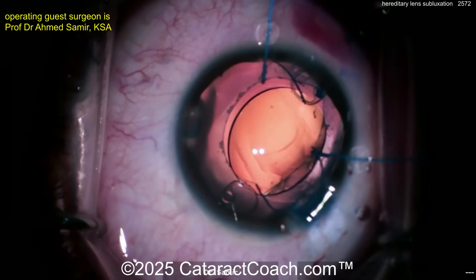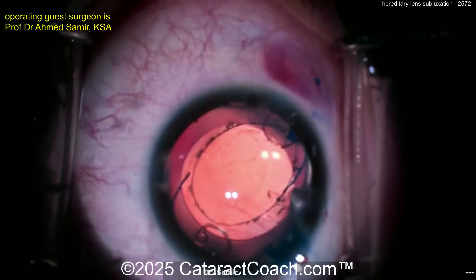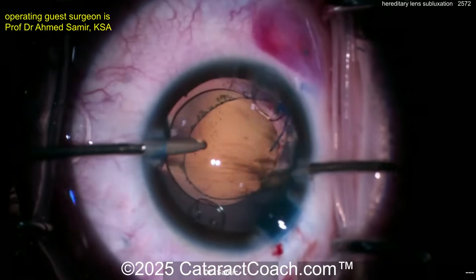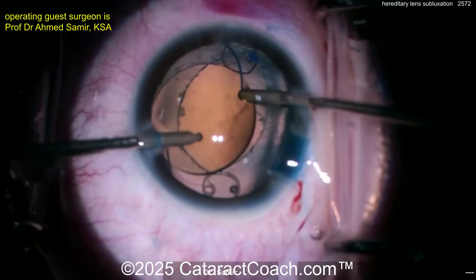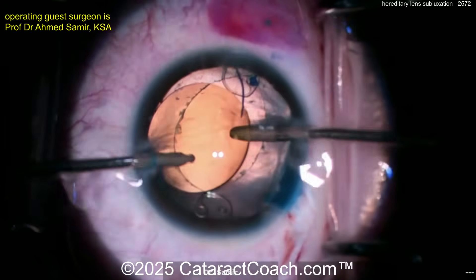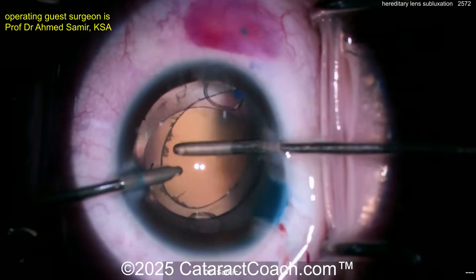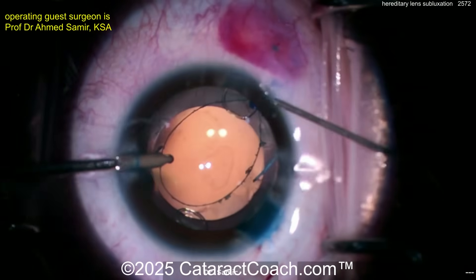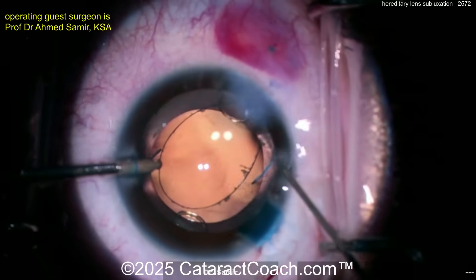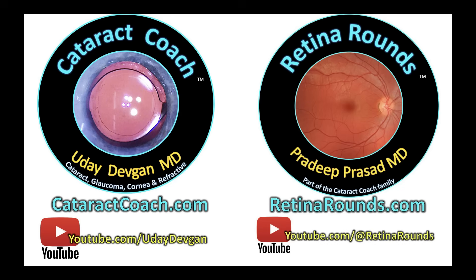There's an eyelet on the other side as well — not sure if the surgeon used the other eyelet. Here comes a three-piece lens going in the bag — dial that in nice and easy. Are we going to use the second eyelet as well, or call it a day? You can leave it sufficiently supported for now and come back in the future. With a second eyelet and a three-piece lens, you have many more options if needed. Beautiful case — seal this up well, and for a pediatric case I'd definitely put a suture in the main incision. Thanks for sending your video in — check out Retina Rounds, our sister podcast!